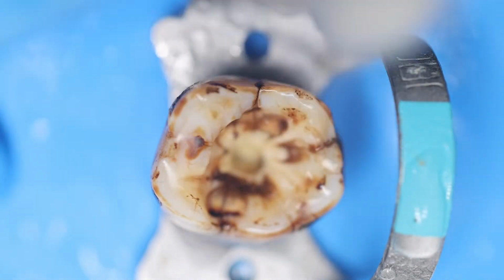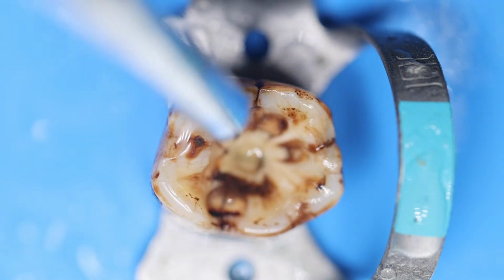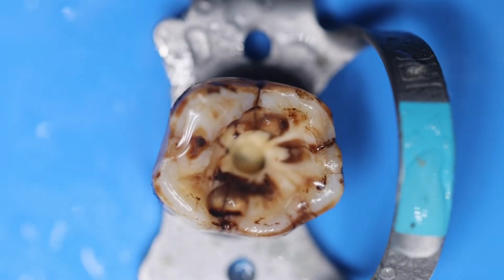We got this drop. This is the drop that we were talking about. When we are slowly going, you can just focus on that area.